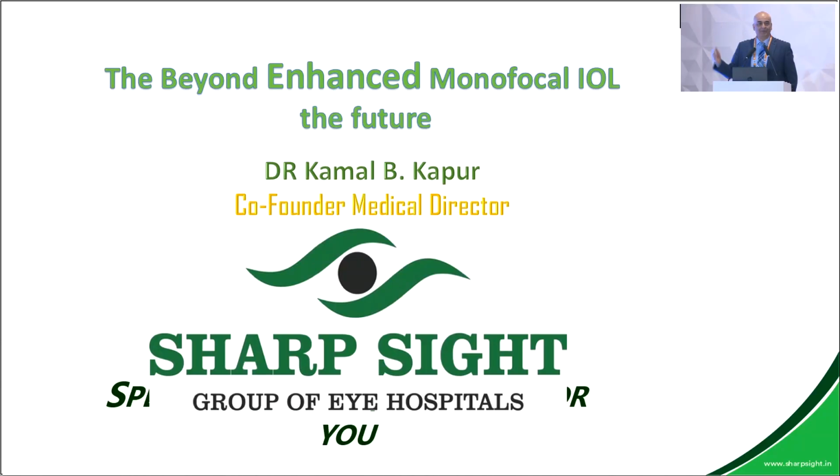Just 4 points from the previous session are, for people who don't have fancy equipment like IOL Master or Cirrus or Pentacam, your good auto-refractokeratometer with good imaging system can serve very well. I probably have the highest volume of phakic lenses in this part of the world, 6,000 plus. And I have patients operating in 18 of my centers. Not all have these equipments, and we are doing very well.